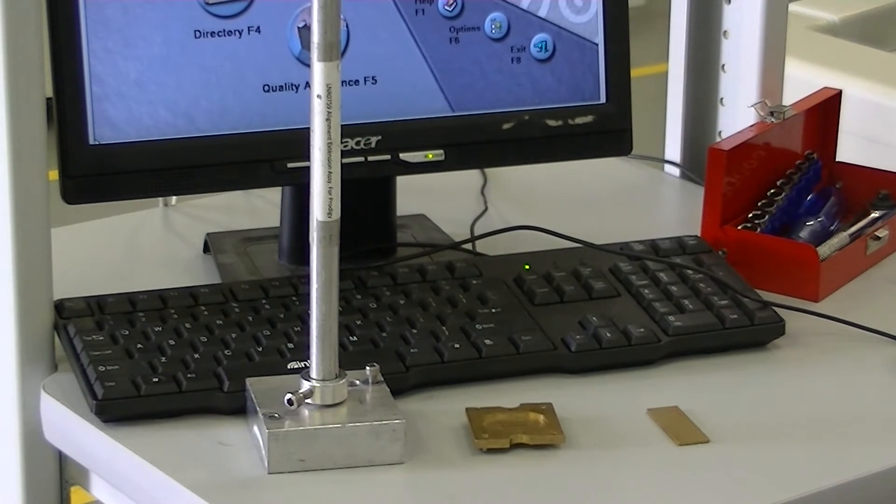This video will explain how to calibrate your Prodigy machine. Tools you'll need include a peaking brass, alignment plate, aperture, and alignment rod.